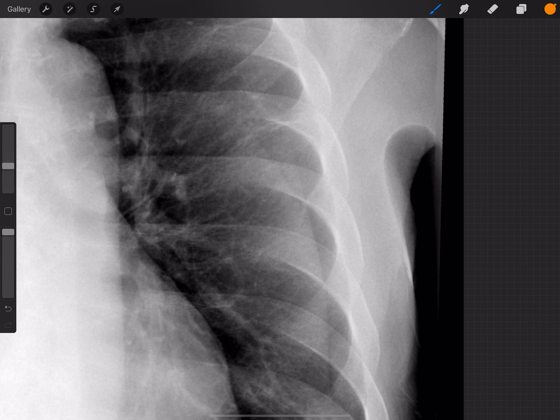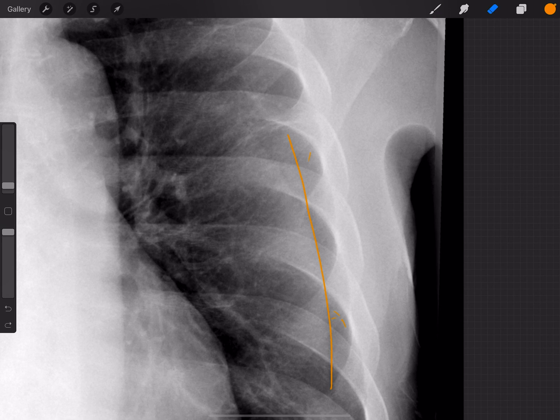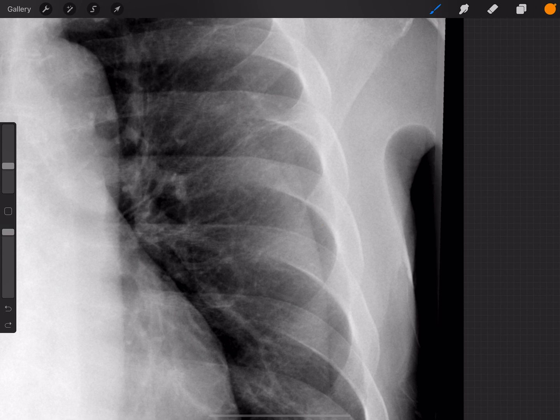Why is this a skin fold and not a pneumothorax? The main reason is that this is not a radio-opaque line — this is a radiolucent line, and lateral to this line, although it's subtle, we still see very fine lung markings. Also notice that if you follow this line up, it doesn't continue upward; it just fades away. That's another sign we're looking at a skin fold and not a pneumothorax.